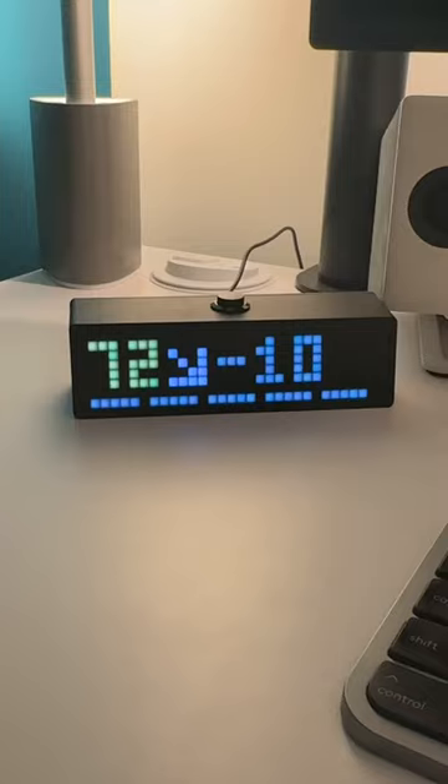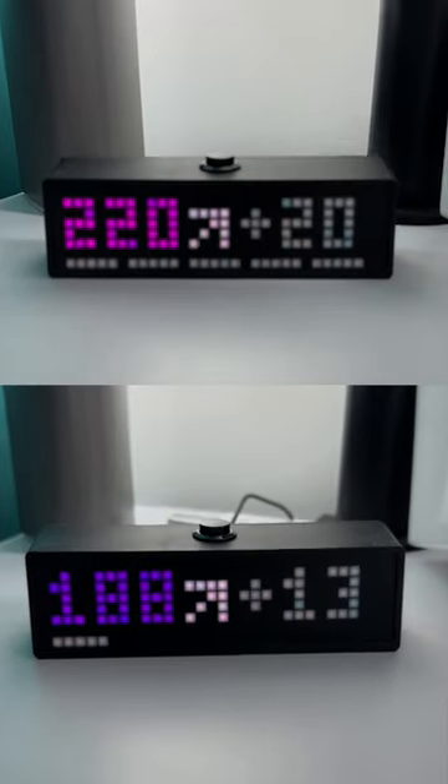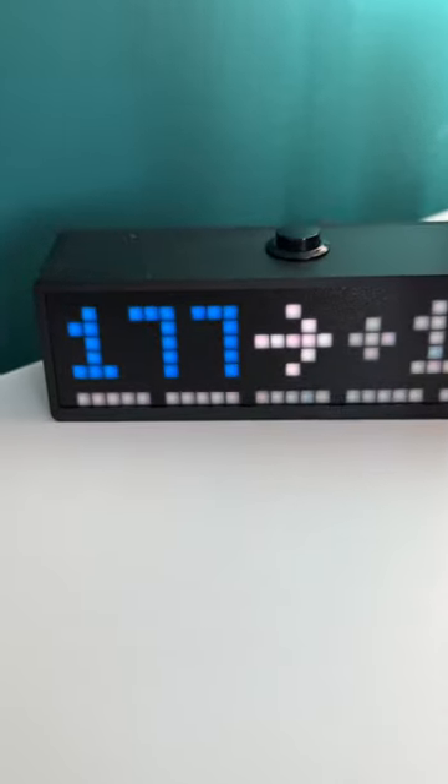Red if I'm very low, yellow when low, green in range, purple and pink when high. If it isn't getting readings, the number turns blue.